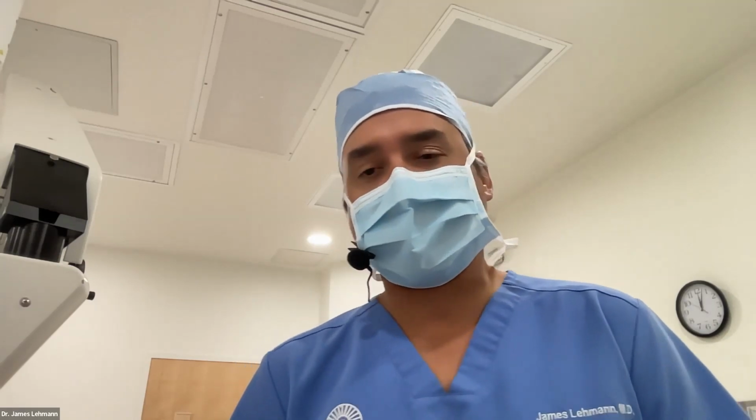But like I said, if there's no problem, if you're comfortable and you have good results operating superiorly, there's not a problem with it. I just feel it's much more comfortable to operate temporally. Yeah, and again, this is going back to what you said. What works best in your hands? What are you most comfortable with? But if the surgeon's not comfortable and the surgeon can't see, it's not going to be an ideal surgery.